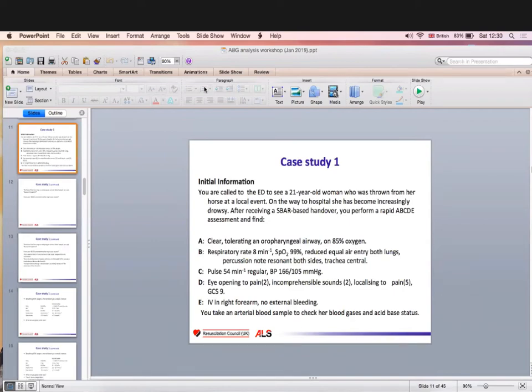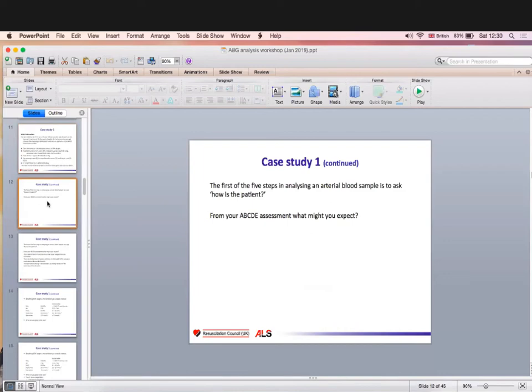So ideally, the patient should have a partial pressure of oxygen more than 400, but he's having around 150, the value which we put, but it's low. And bicarb is 22, that's slightly reduced, and base excess is minus 2, and lactate is 2. That's the hypothetical one. So let's see what the real one is.